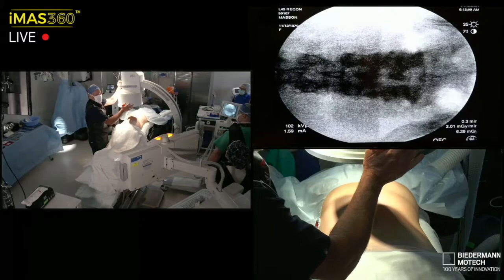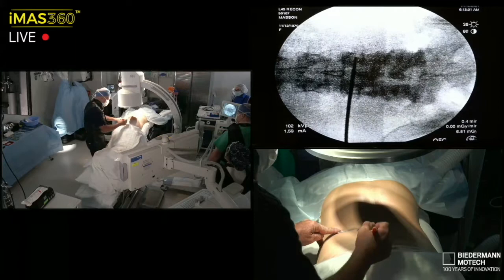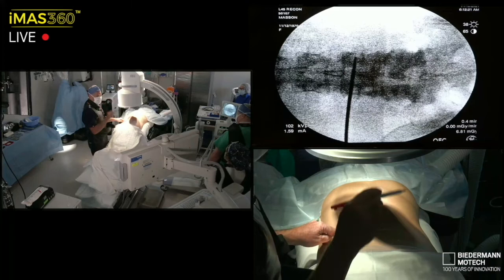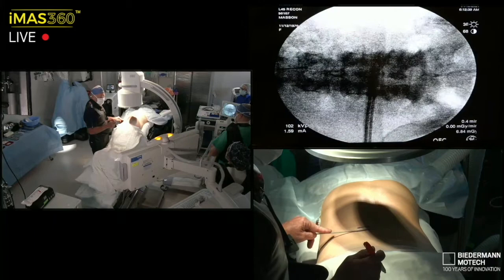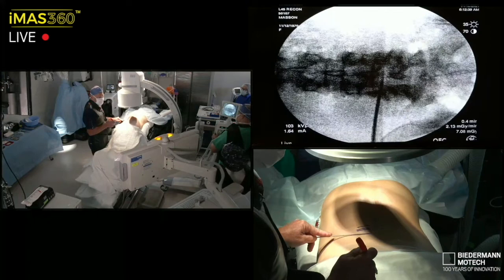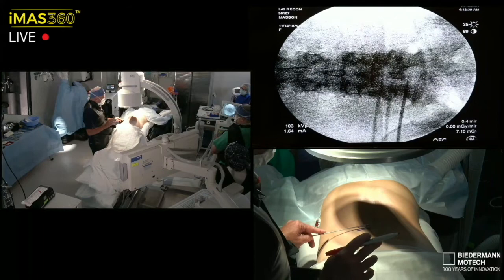Superior end plate view, so I've got a nice view of the pedicles. Low lateral L4 left entry point, low lateral L4 right entry point. So that gives us the relative splay for the screw map. This pedicle to pedicle to midline is the zone at 4-5 where we're going to need to get facetectomy, interbody, broad decompression. On AP view, you can see the excavated bone work done here from the original decompression. So there's already a significant decompression zone. We're going to go from lateral to medial, managing the bone so that we creep into that dural margin. But we'll make sure we get all that.